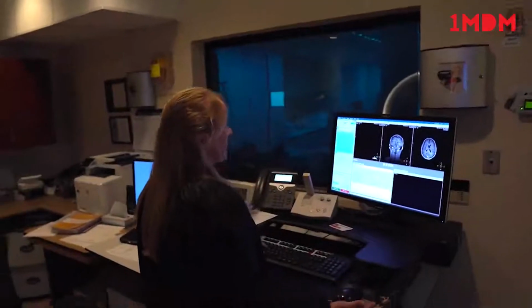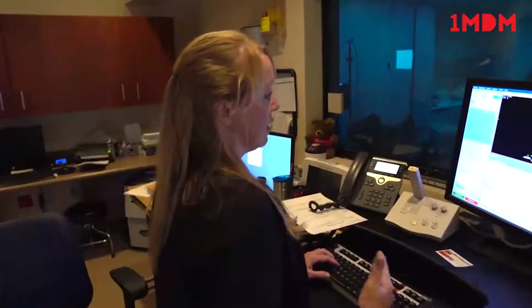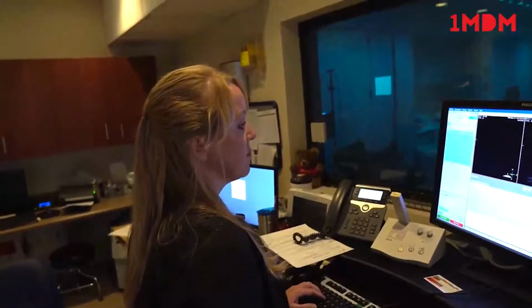So MR makes a lot of different sounds. And so I'll just give you some random different sequences, the different noises that they'll hear while they're in there.